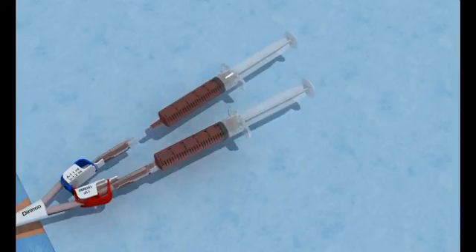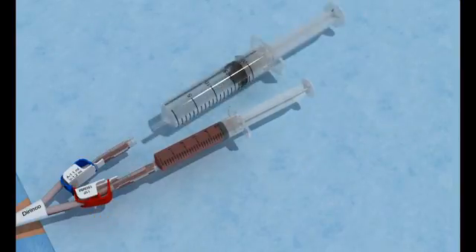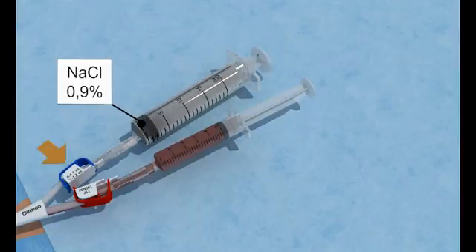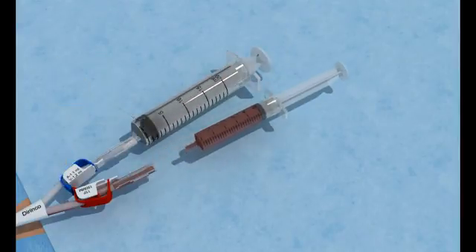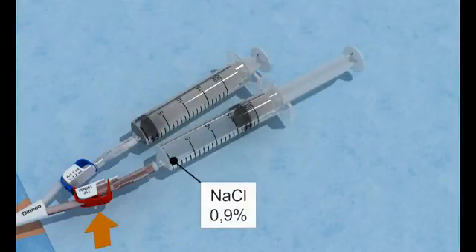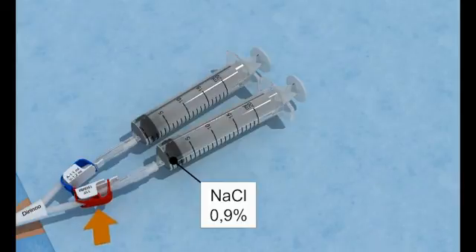Flush both lumens. Replace the aspiration syringes one by one with 20ml syringes filled with a sterile 0.9% saline solution. Open the clamp and flush the lumen. Close the clamp. Repeat the same procedure for the other lumen.